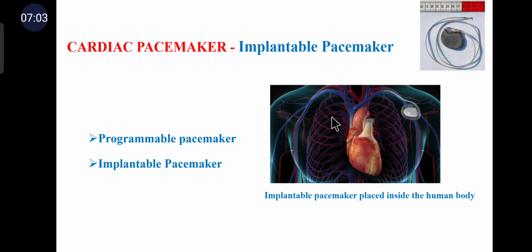The pacemaker is a miniature pulse generator and is powered by small batteries inside the device. The circuit is designed so that the battery supply is sufficient for a long period. Since the pacemaker is located beneath the skin, replacement of the pacemaker unit involves relatively minor injury, and it is a routine procedure.